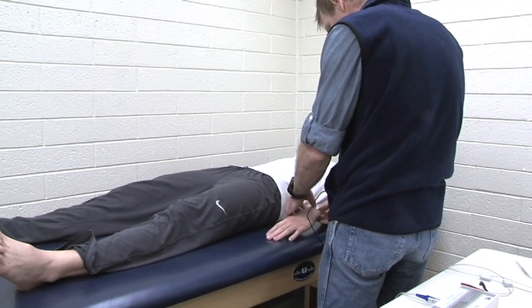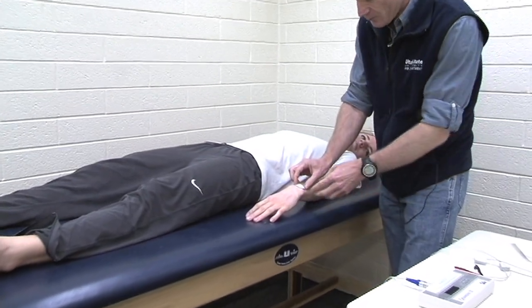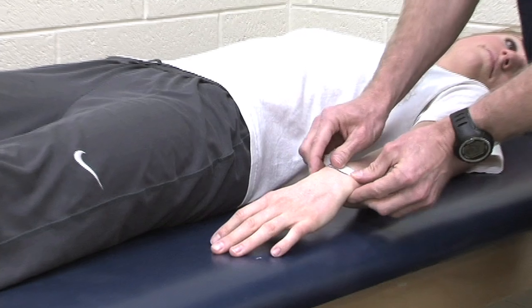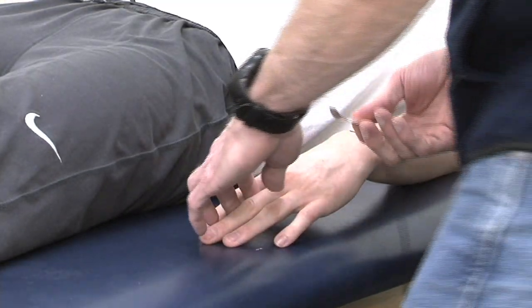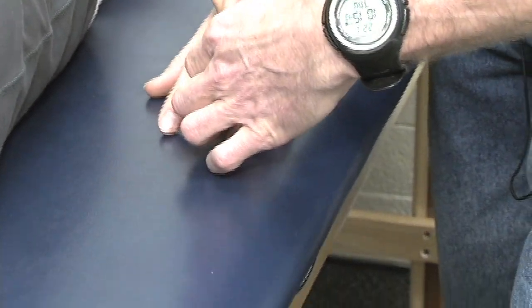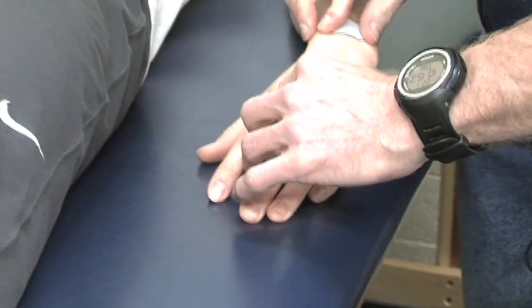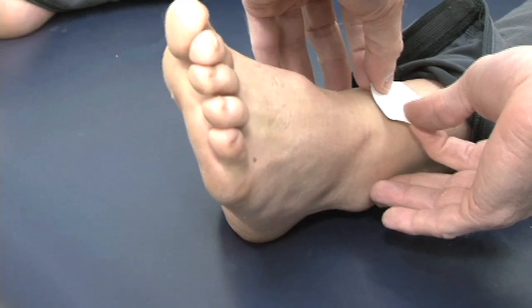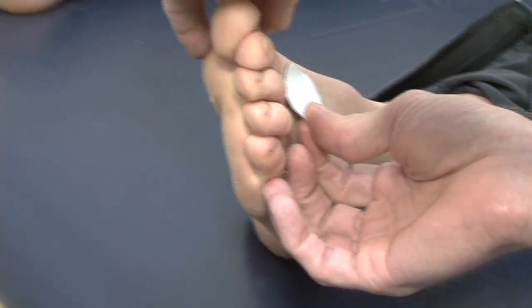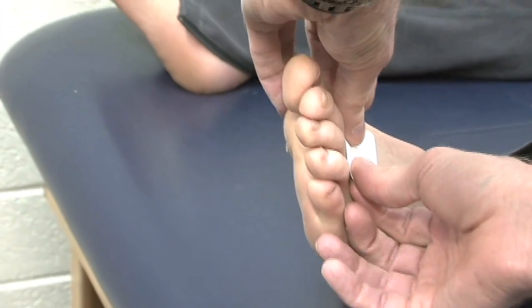I'm using some anatomical landmarks here, bisecting the styloid processes of the radius. And this one goes down on the proximal phalanx of the middle finger. Down here, I'm going to bisect the malleoli, and then we put this one down at the base of the toes.